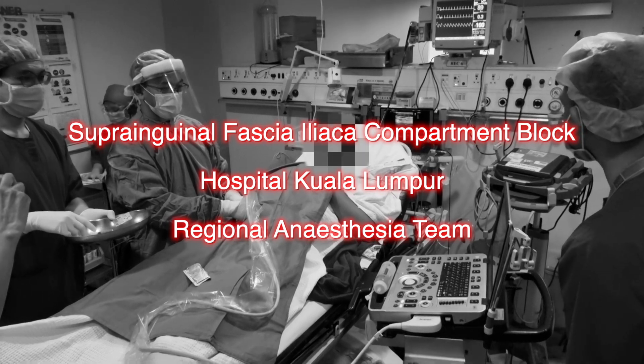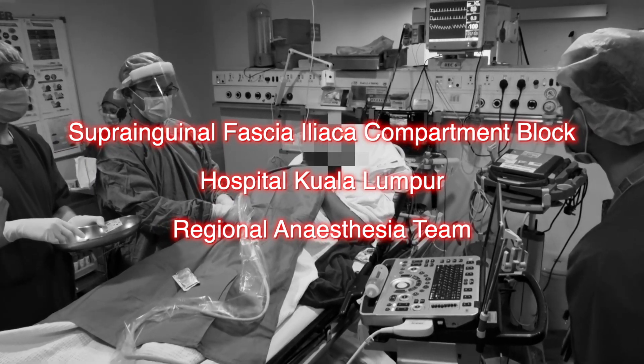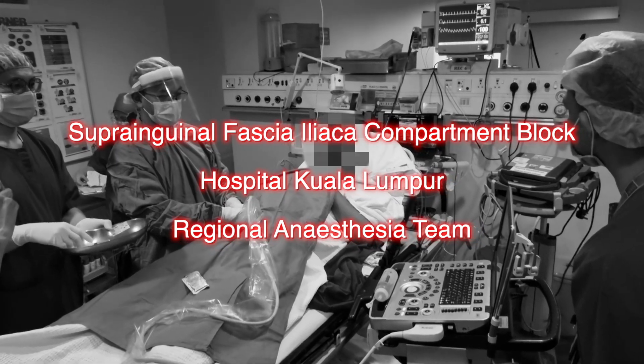Hello everyone. This short video will describe and demonstrate the performance of the suprainguinal fascia iliaca compartment block.